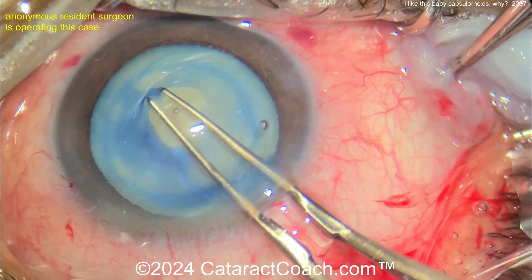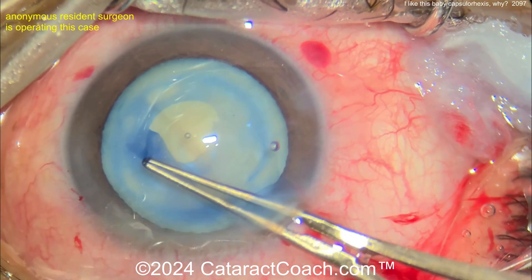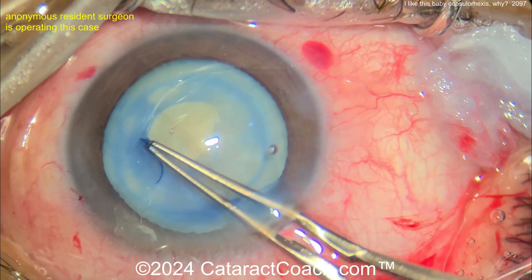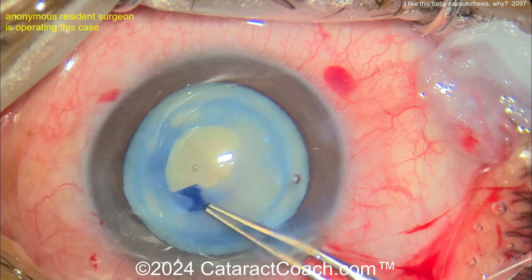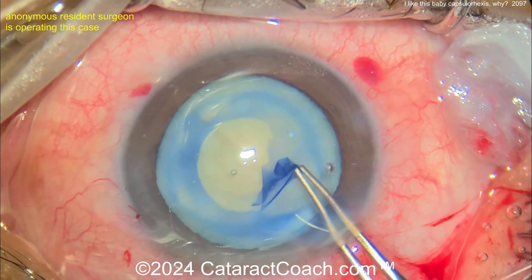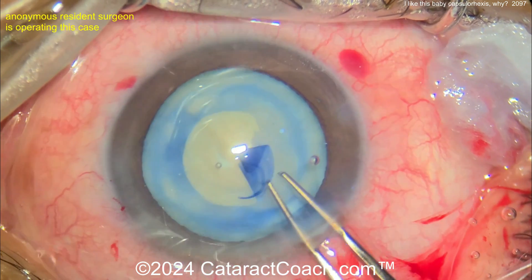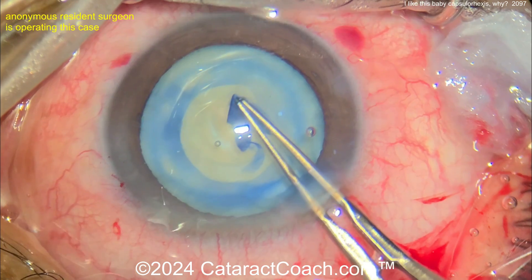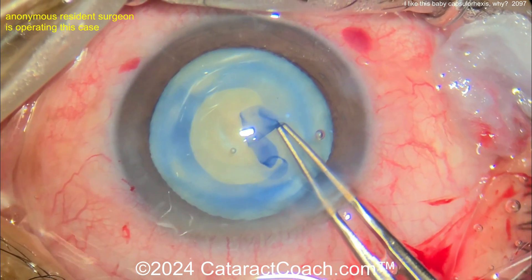Here we go — grabbing that and making it a little bit bigger, spiraling it out. The spiral-out technique is a nice way to dial in the exact size you want and also to ensure that it doesn't run out on you. After that decompression with the Simcoe cannula, we're pretty safe — it's not going to run out anymore. Now getting that rhexis done, aiming for hopefully about a five-millimeter rhexis.